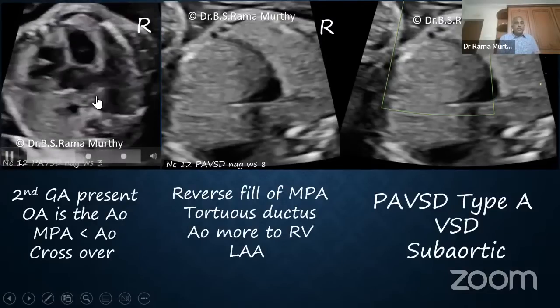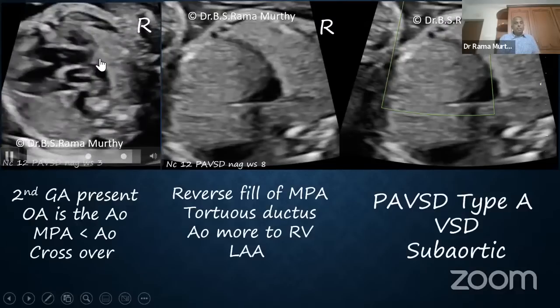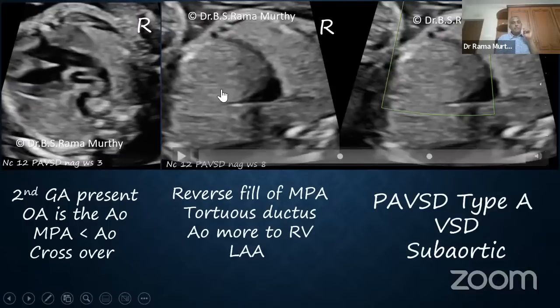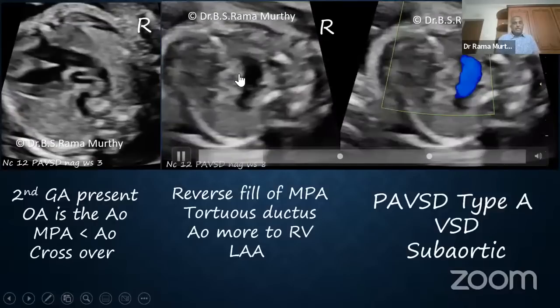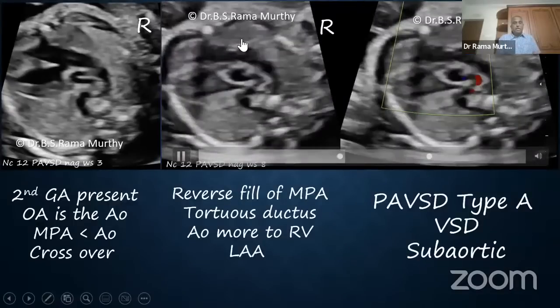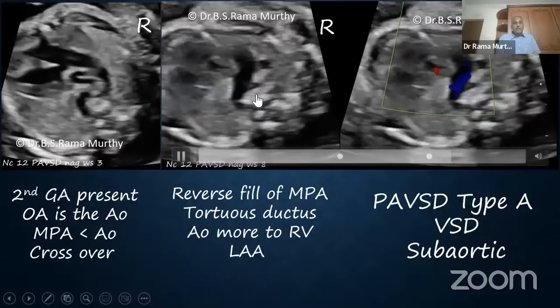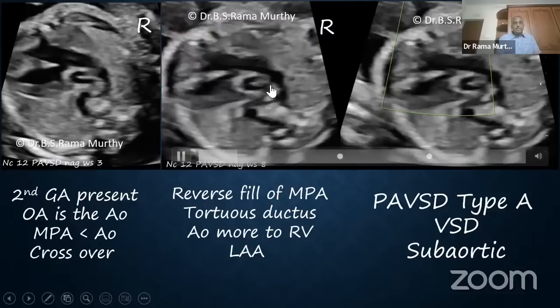So there is indeed a second artery. There is indeed, yes, there you are. This is the big artery overriding and of course the arching. So you know the overriding artery is arching. Now let's go to this clip on color, and you can see that this is the overriding artery, which is really large and huge. That is the aorta. This is the SVC. This is the trachea. Yeah, that's the trachea.